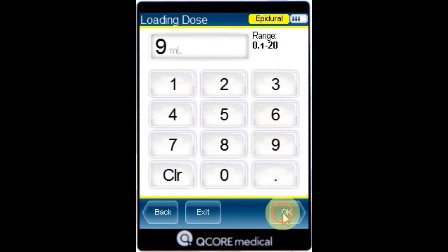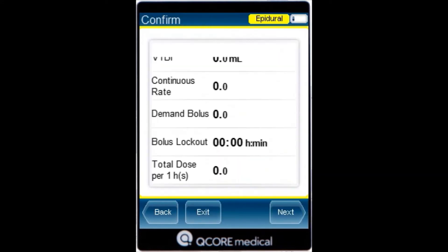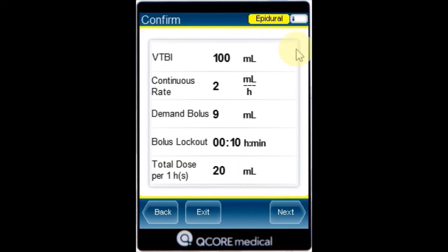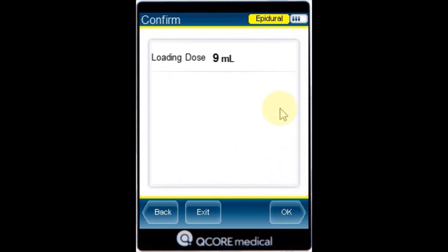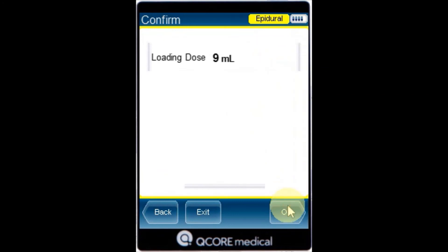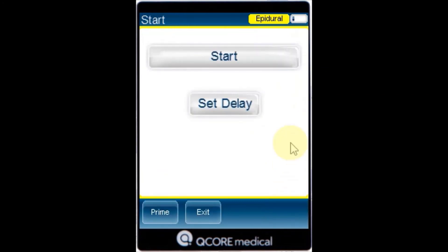Review the parameters displayed on the confirmation screen and press OK. To begin the infusion make sure that all clamps on the administration set and any other connected devices are open, and press start.